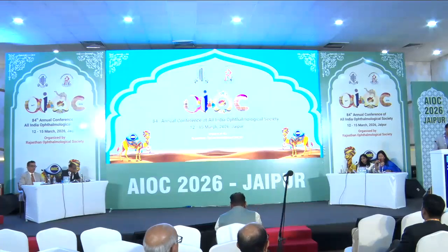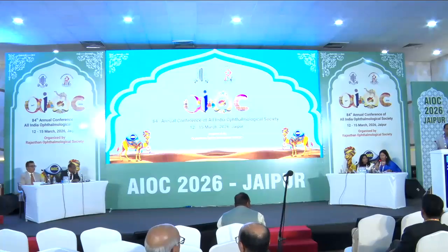Good afternoon, all. I'll be presenting a technique known as X-NEED for SFIL, which can be done easily by anterior segment surgeons. It was proposed by the Aravind Eye Care Group for scleral fixated intraocular lens, known as the X-NEED technique. The case discussed involves a traumatic cataract following surgical aphakia.